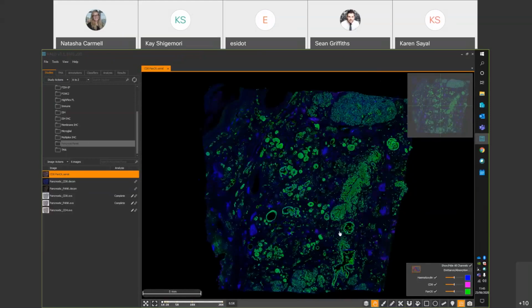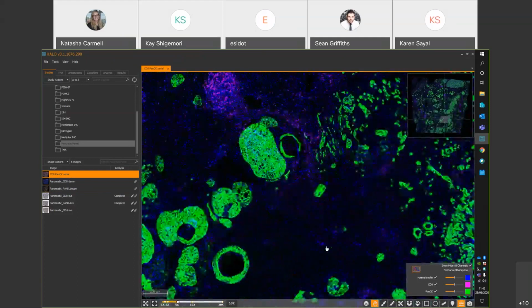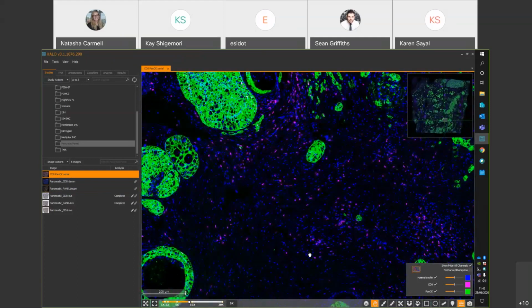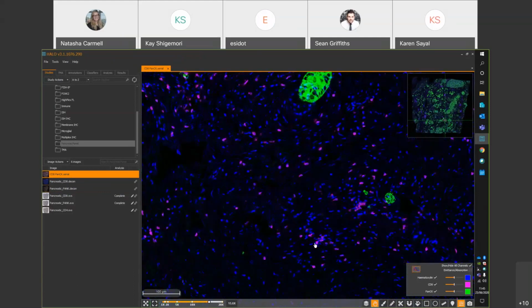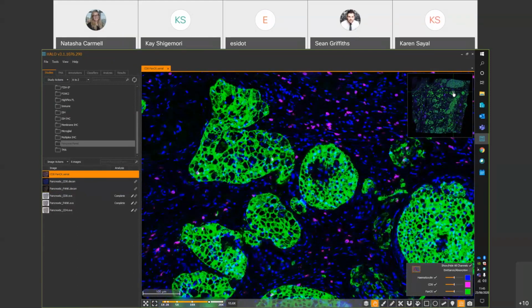And what we can see here now is we've got the pseudofluorescent fused image with the hematoxylin, the CD8 and the PanCK, and it's a .serial file generated almost instantaneously. But what that means is the fusion is generated almost on demand. So we zoom in to this region and it will kind of be fused as we zoom. If we move up to a different image, it'll again just take a second or two whilst the fusion occurs.